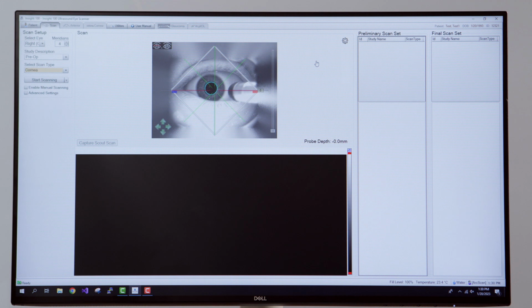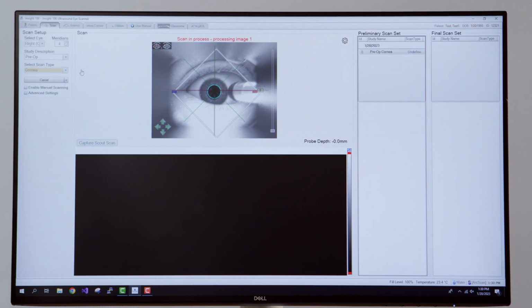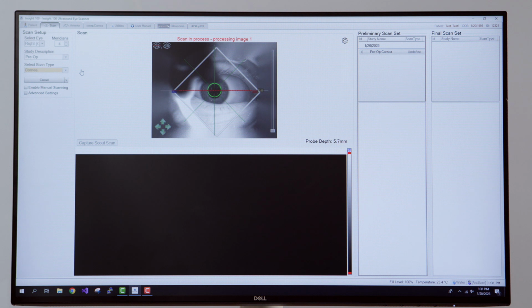Instruct the patient to open their eye when they're ready and find a spot on the fixation light, keeping their gaze steady. Center the crosshairs on the pupil by double-clicking in the center of the pupil. Click Start Scanning. The ultrasound probe will sweep across each of these 4 meridians. As each of the images load, look for bright white lines, ideally spanning the width of this view.